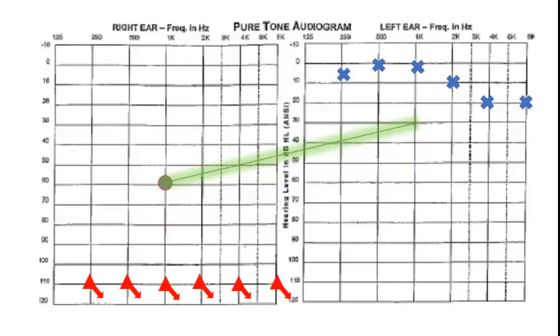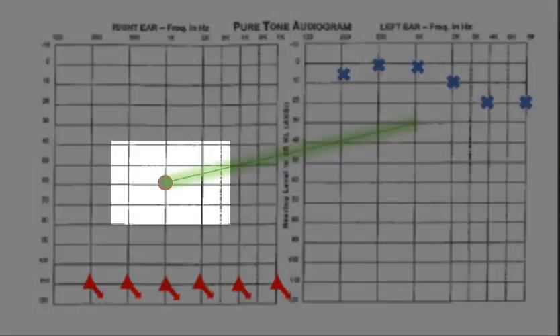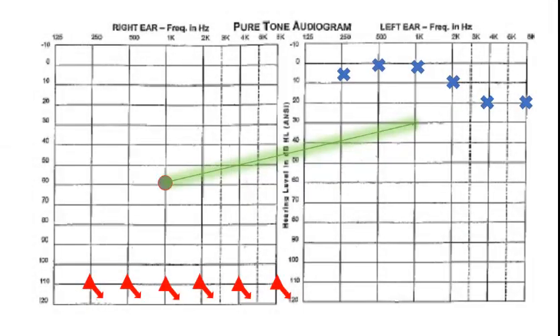As we know, it's possible during air conduction testing that even if you have an ear with no residual hearing, we can deliver a test signal to that ear with air conduction and the person will respond. The problem is that they're not responding by hearing the signal in the test ear. It can cross to the opposite unintended ear, where they might be able to hear it. This is known as a shadow response. So when we see that the potential crossover exceeds the cochlear hearing of the non-test ear, we know that masking is required.